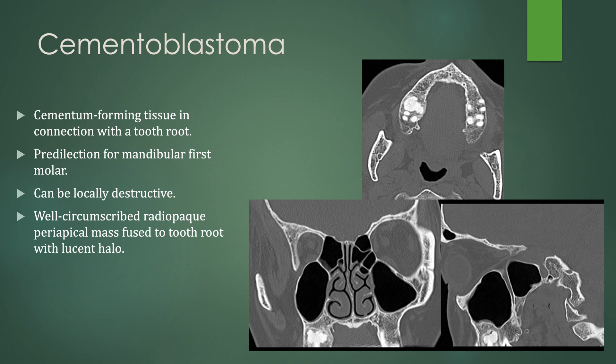Cementoblastomas are cementum-forming tissue in connection with a tooth root. They have a predilection for the mandibular first molar. They can be locally destructive, but they present as well-circumscribed radiopaque periapical masses fused to the tooth root, and they also have that lucent halo. You see this area of sclerosis at the root of the tooth with a peripheral lucency — visible on axial but better seen on sagittals and coronals.